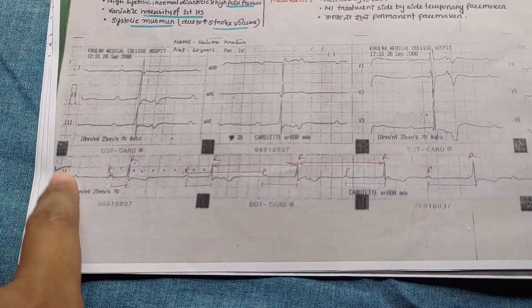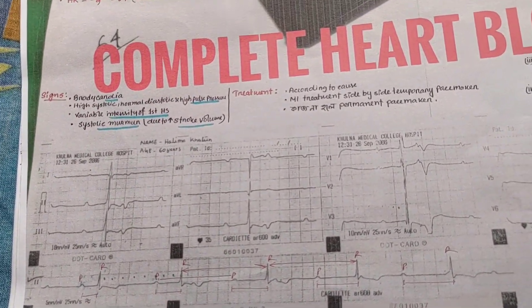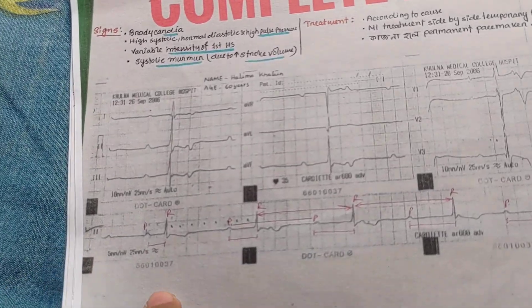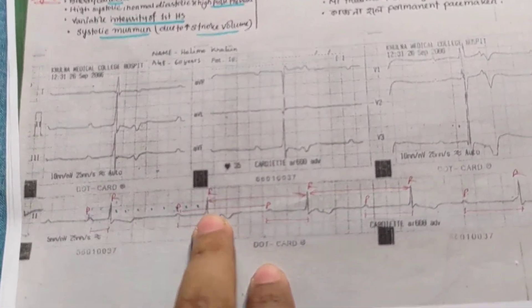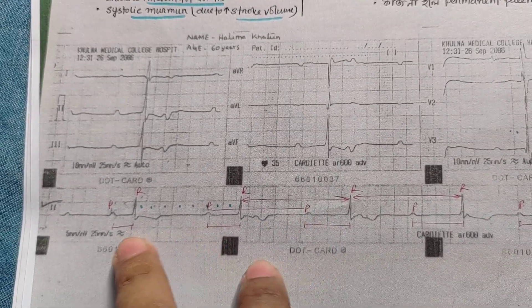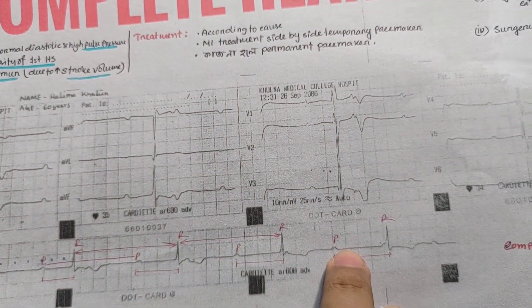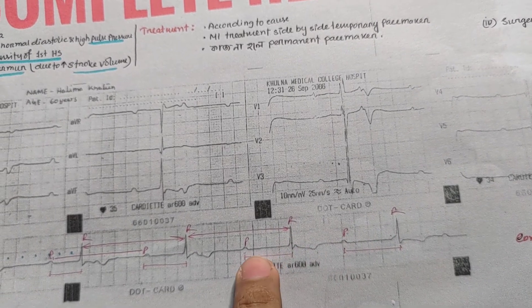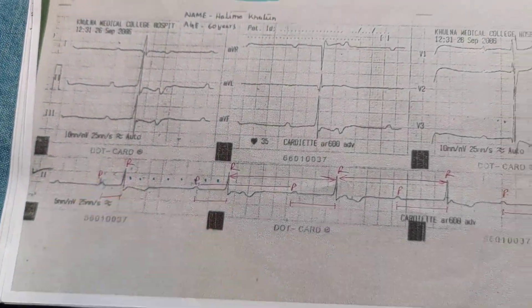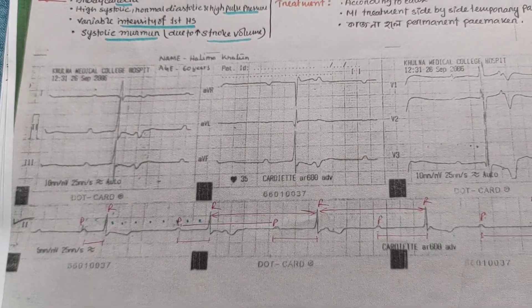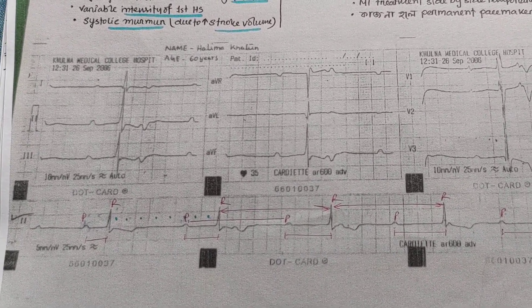Lead 2. This is abnormal. First of all, there is a variable PR interval.